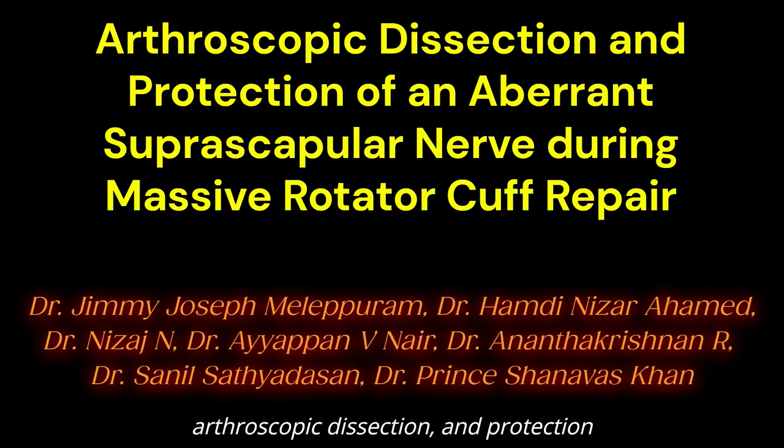Arthroscopic dissection, and protection of an aberrant suprascapular nerve during massive rotator cuff repair.